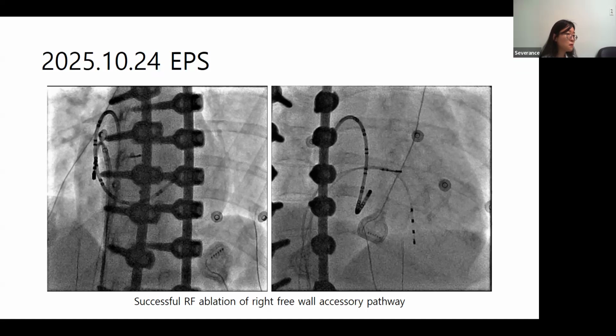For example, SR4 was designed for reaching the right posterior septal all the way around like this. However, a long curvature has less freedom, so it is difficult to manipulate.